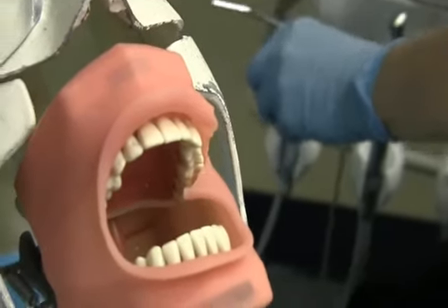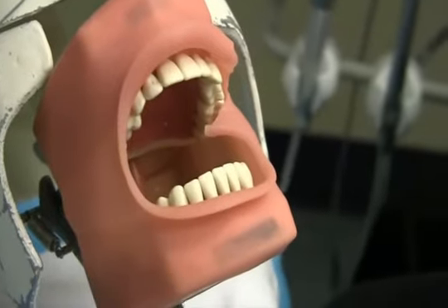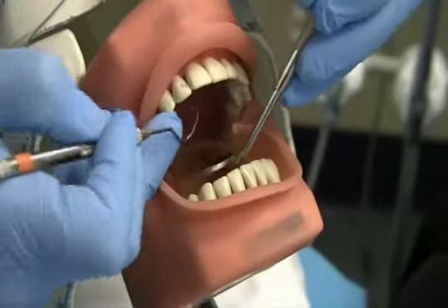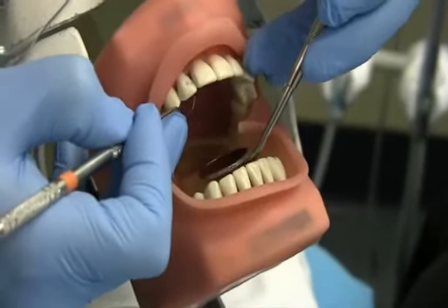Assuming that approximately 10 minutes has passed, the dental assistant would then pass the dentist the mirror and explorer to ensure that the tissues are sufficiently numb, meaning that the tooth is ready for removal.